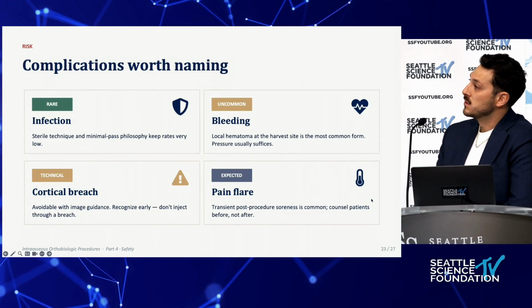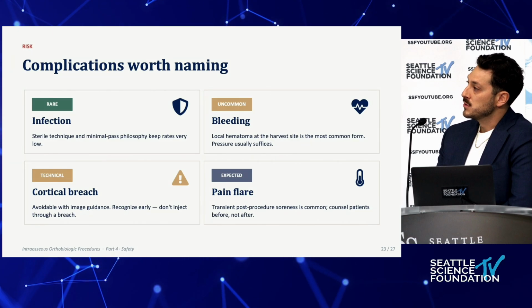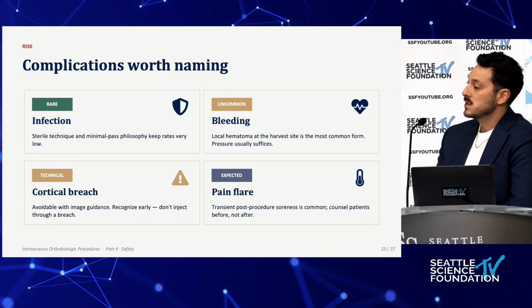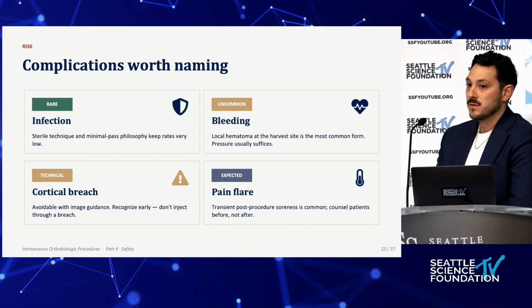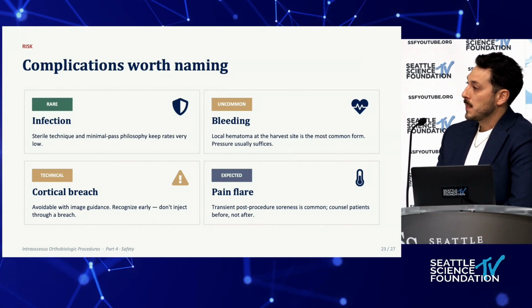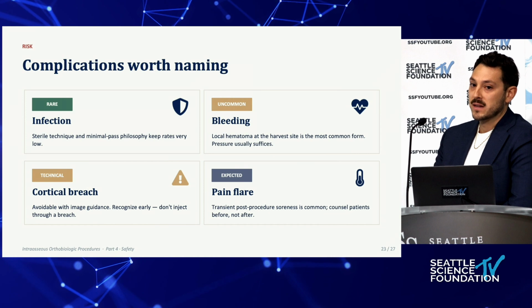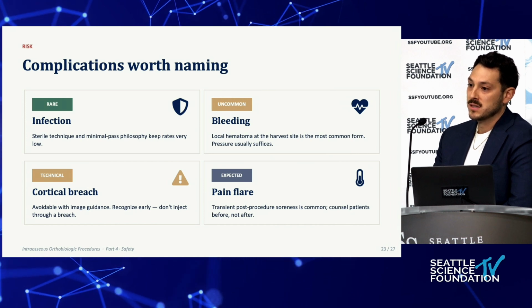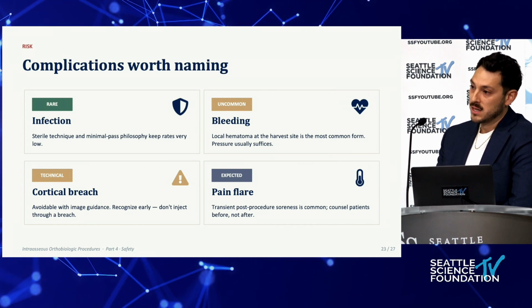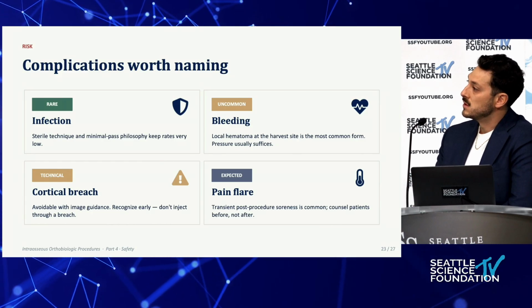Like with anything, this is going to be something that's under a total surgical, sterile approach. Typically, I don't use antibiotics for this. You can if you're going to be nervous, but not totally necessary. You want to have all of your safety views to make sure that you're not going to go too deep. If you're not familiar with accessing bone in the hip, knee, or shoulder, you just need to get comfortable with your bone windows. And if you're comfortable in the spine, it translates very easily over to the peripheral joints.